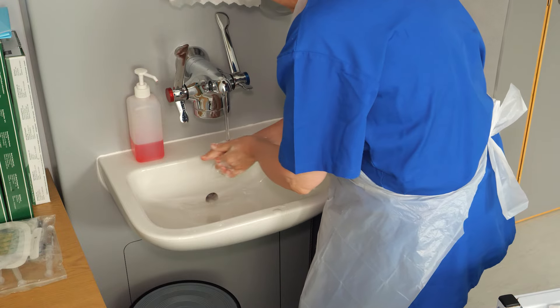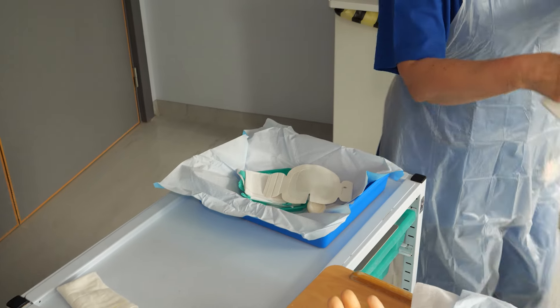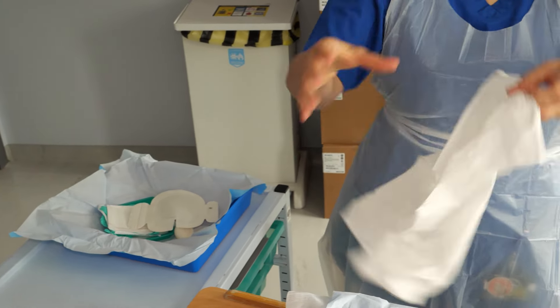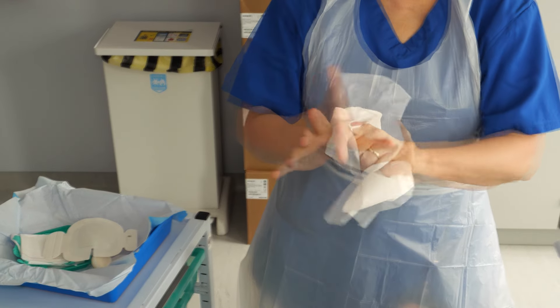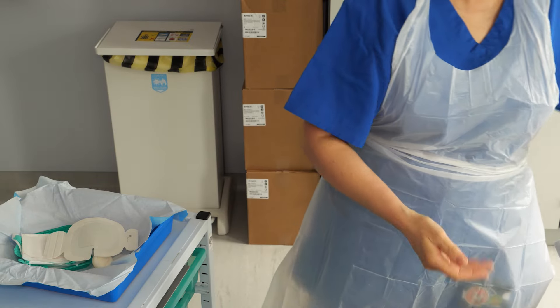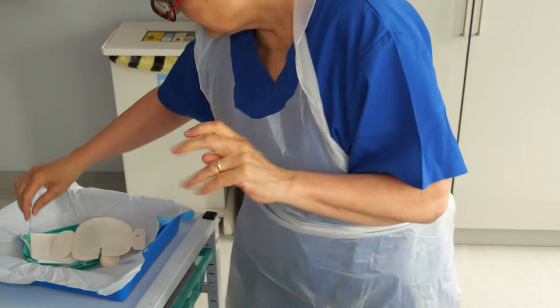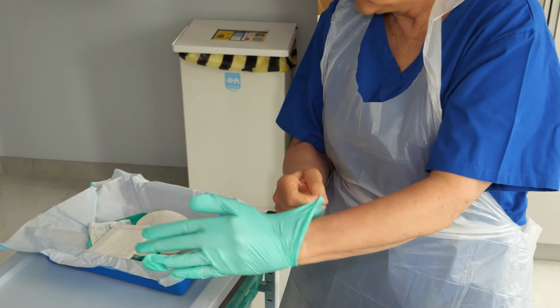Wash your hands and dry them thoroughly with the paper towel found in the dressing pack. Then put on the gloves from the dressing pack.